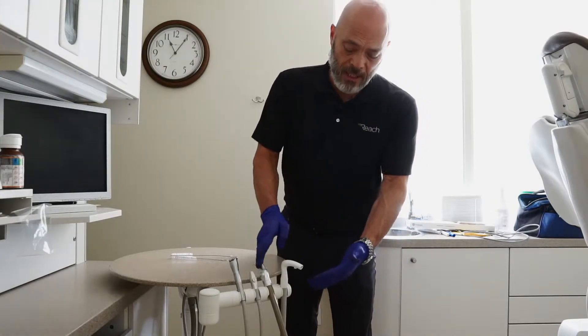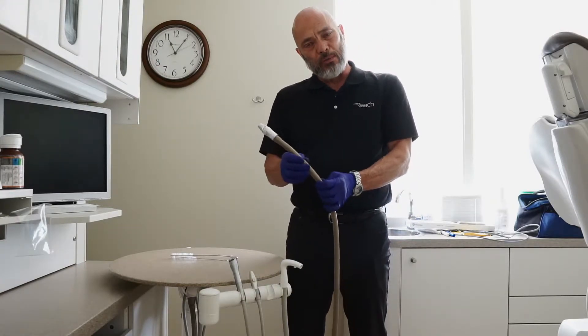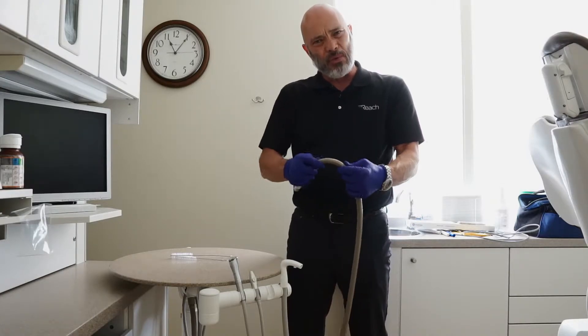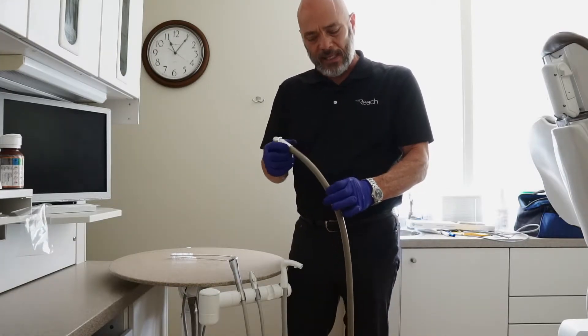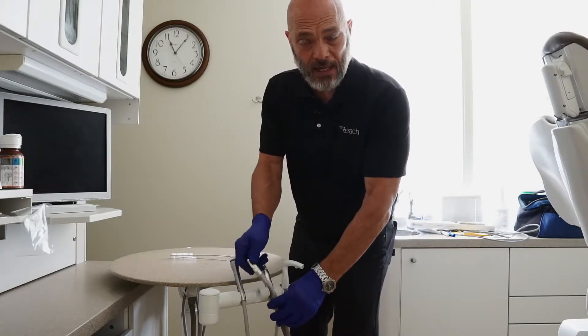It starts here. The tubes can be restrictive — old tubes can build up debris on the inside, and also just the rigidity, how stiff they are. These tubes are inexpensive and can easily be replaced, but they can also compromise your vacuum flow.